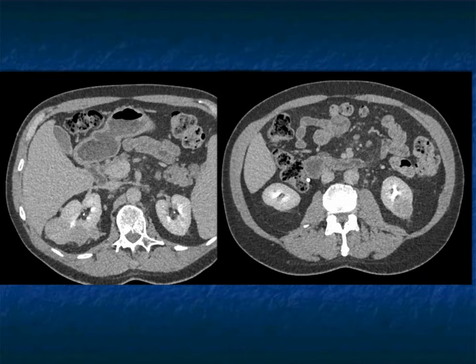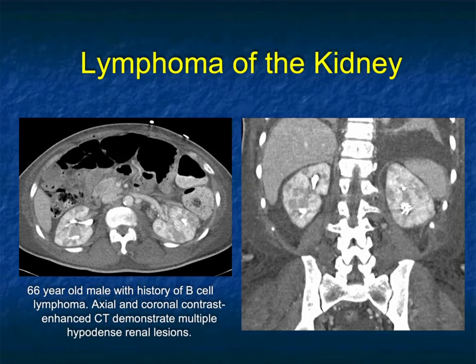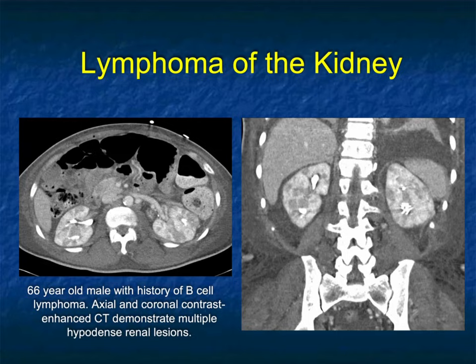On late phase imaging, there's a mass in the lower pole of the left kidney and subtle things in the right kidney. When I see bilateral involvement, I think about metastasis, infection, infarction, or renal cell — though RCC is rarely bilateral. But bilateral disease makes you think about lymphoma. Here's another patient with B-cell lymphoma with multiple small lesions in both kidneys. If the patient was immunosuppressed, aspergillosis or candidiasis would be in the differential, but that was not the history — this was lymphoma.